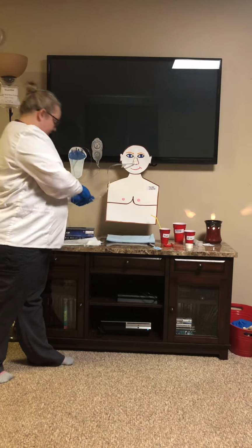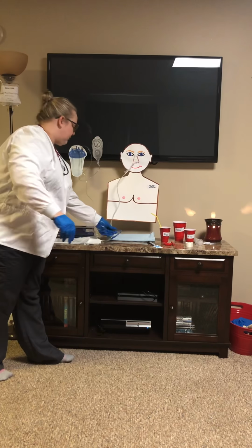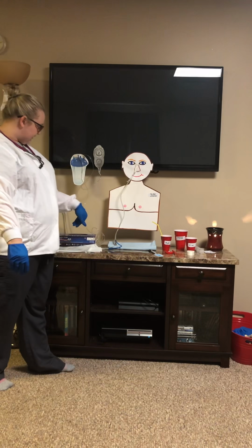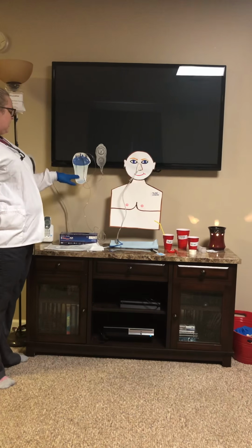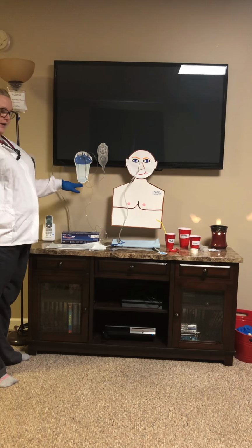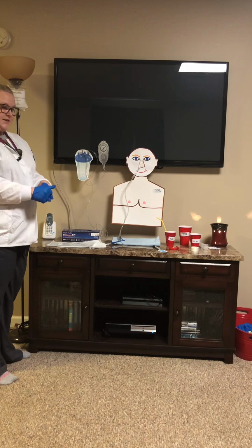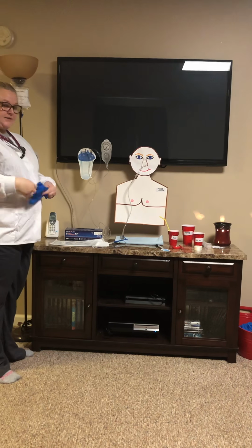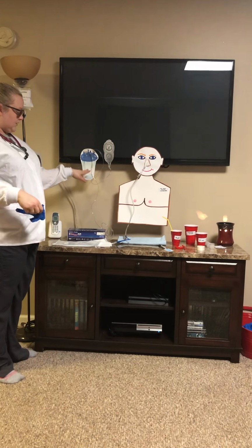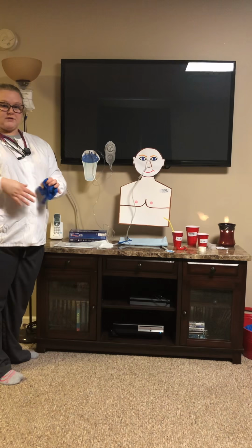I would remove the cap, insert the suction, and I would observe that the suction is successful. And I would observe the contents and document my findings. I would perform hand hygiene, and I would reassess the patient at least every 4 hours as he is on suction unless otherwise stated by physician order or facility protocol.